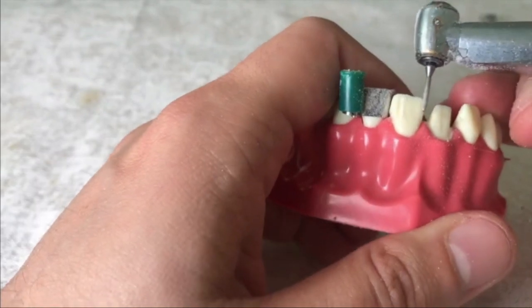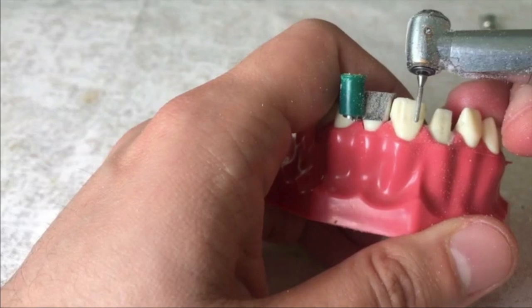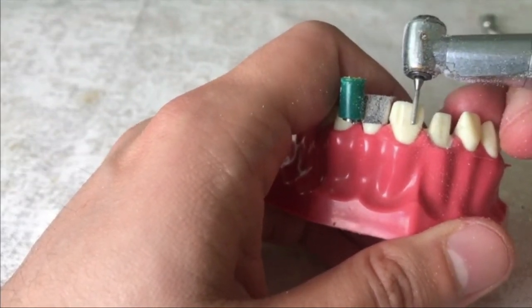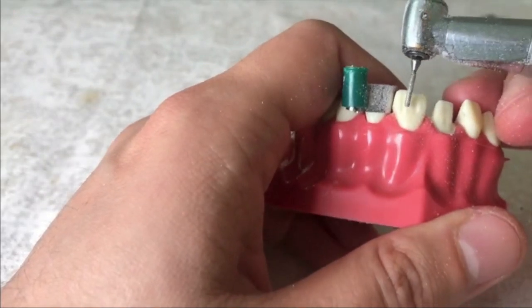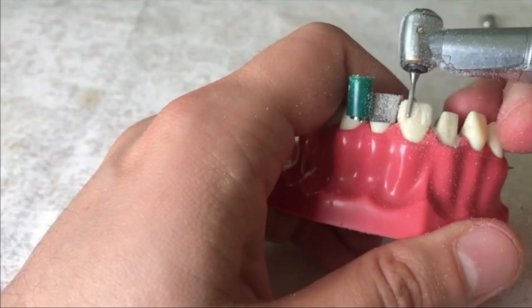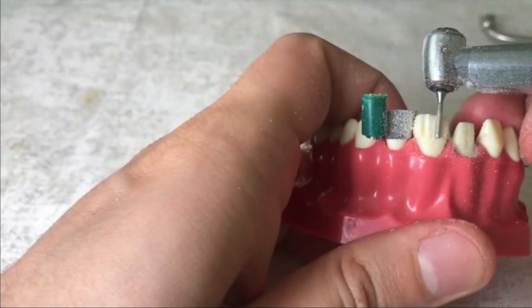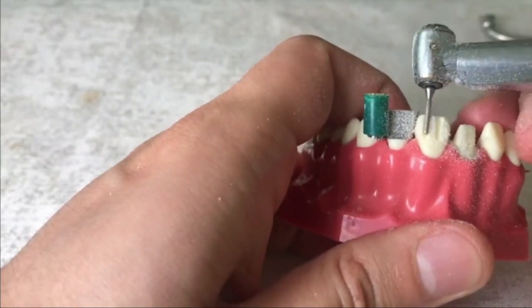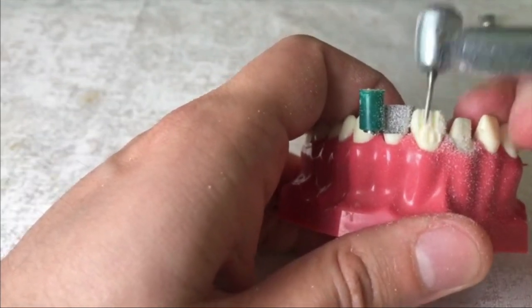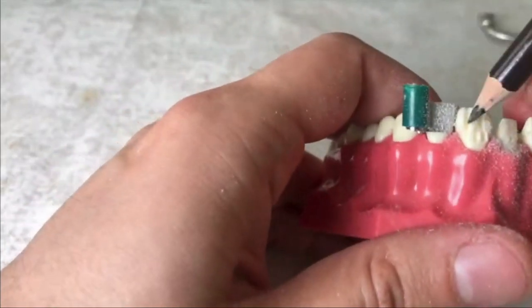Here I started the preparation from the buccal face. I prepared 3 to 4 guiding grooves on the buccal side. After opening the grooves, I paint the deepest points with a pencil. The purpose of doing this is not to lose the absolute depth. When joining the grooves, if I lose the pencil stain completely, it means that I have increased the depth involuntarily.